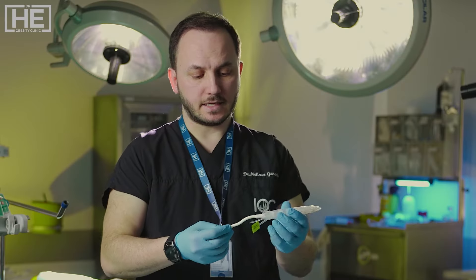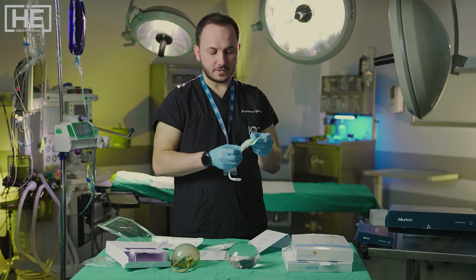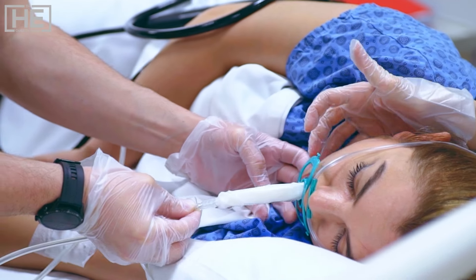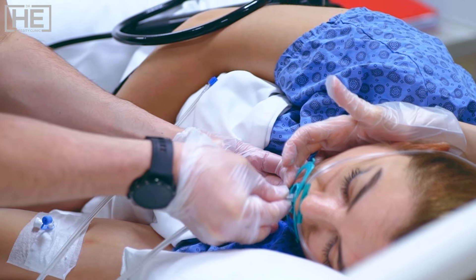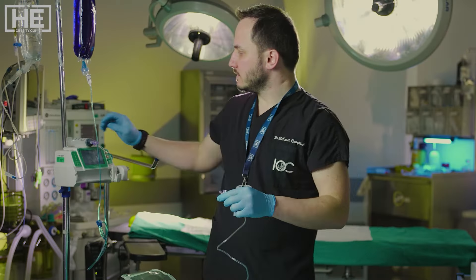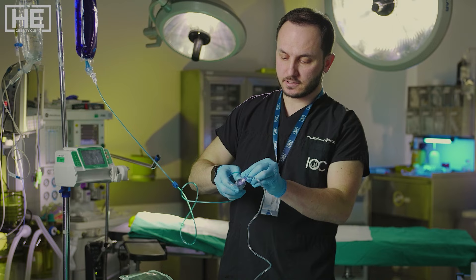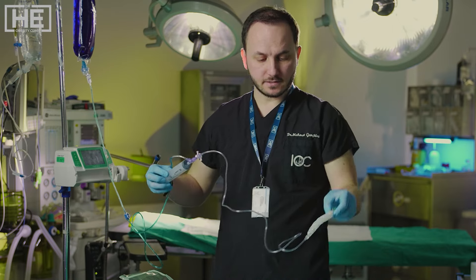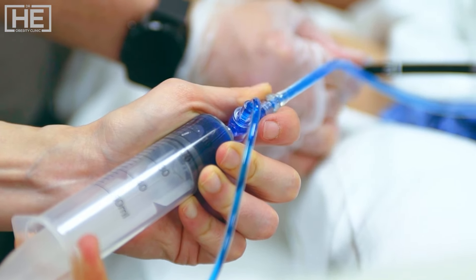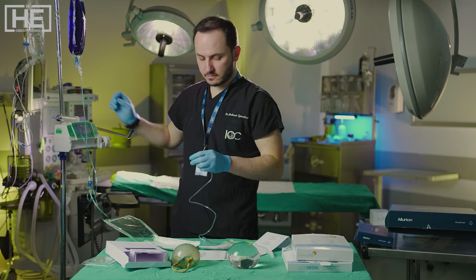This is our balloon. Different from others, it is short. We connect it to the endoscope and insert it. After insertion, this connection tube allows us for inflation. We use methylene blue saline and fill it inside the stomach with endoscopy, trying to cover one third of our stomach size. After inflation, we cut the connection.